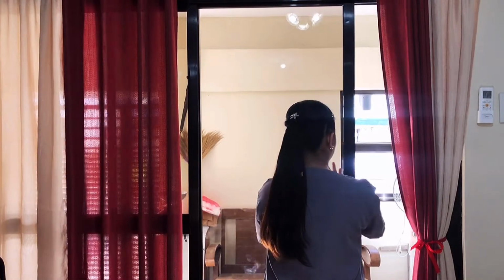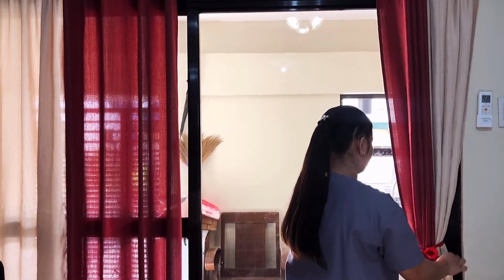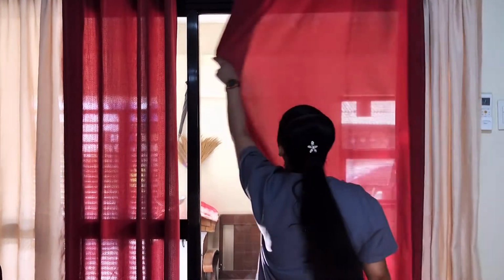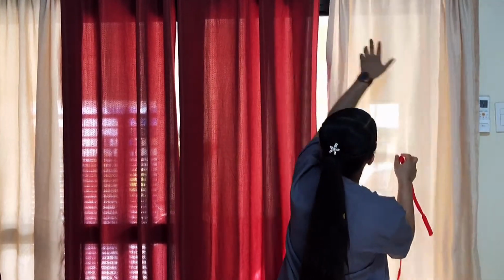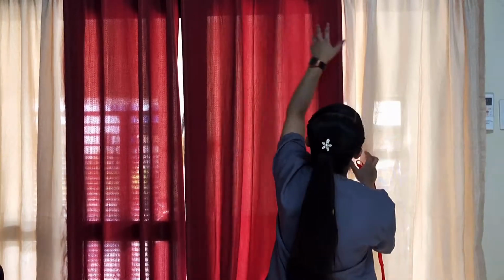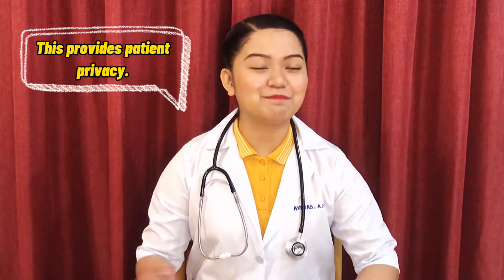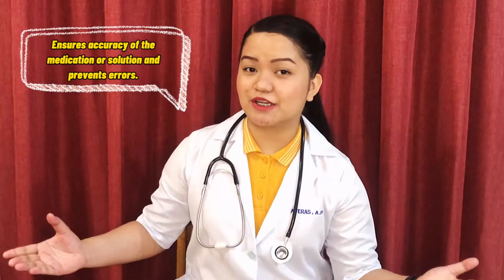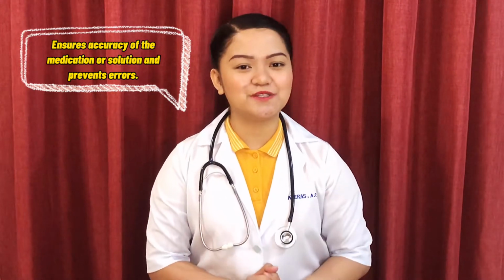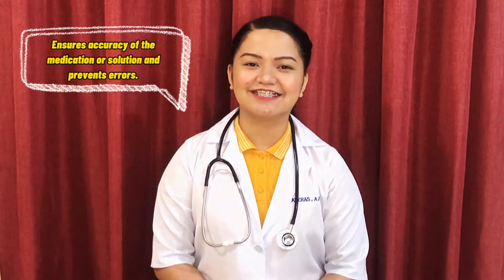And then close the door, as well as the curtain for your patient's privacy. This provides patient privacy. And then compare the MAR to the patient wristband and verify if this is the correct patient using two identifiers. This ensures accuracy of the medication or solution and prevents errors.